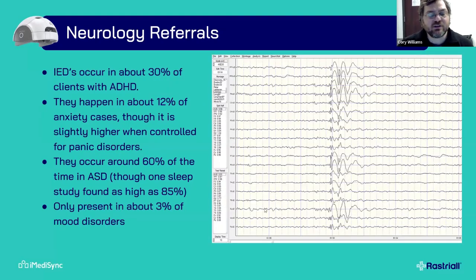Now, as I just mentioned, one of the things that we'll sometimes see in an EEG is something that requires a referral to neurology. So say, for example, an epileptiform discharge. Right? I'm not a neurologist. I don't diagnose seizures. But if I see something like this sort of spike and slow wave, I know that this is potentially indicative of a seizure disorder. And I want to send this patient to a neurologist to make sure that their brain is healthy.